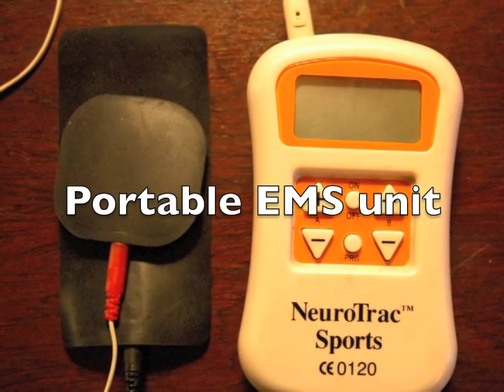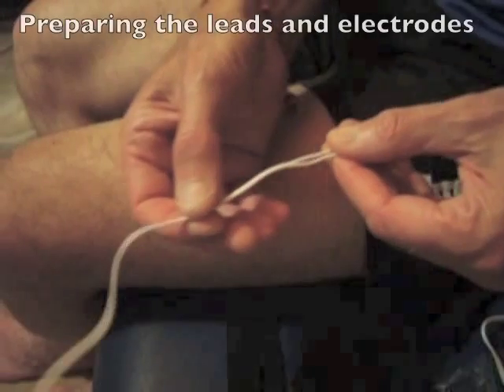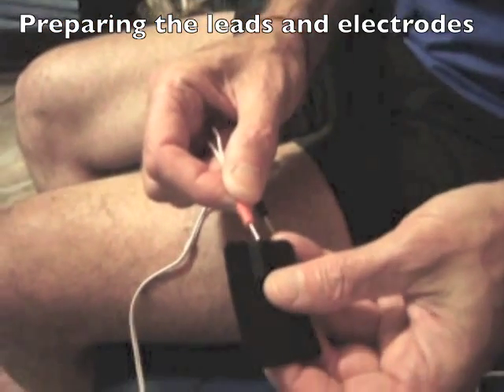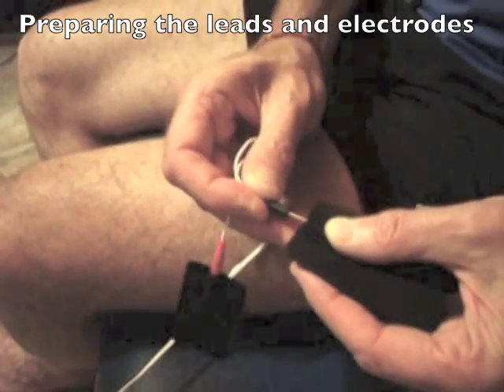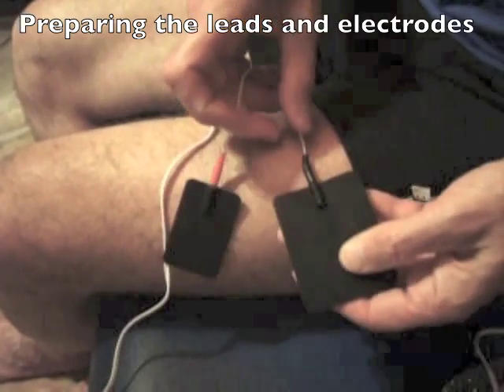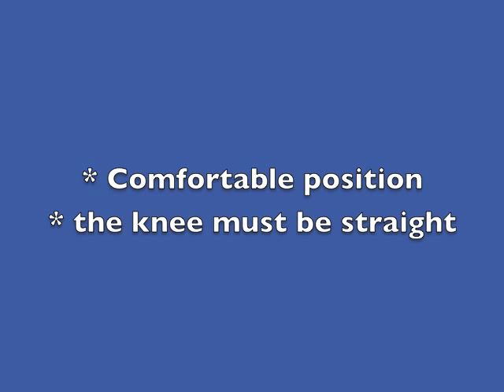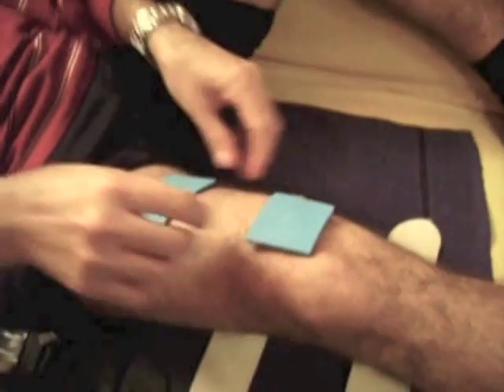For VMO muscle stimulation, it's best to have one bigger and one smaller electrode. The muscle stimulator should stay switched off as you set it up for use. You may need to prepare the lead by separating the wires a little bit, then insert one wire into each of the electrodes. It doesn't matter which wire goes into which electrode as it's an alternating current. Then place the other end of the wire into the contact point on the machine. If you are using rubber electrodes, you need to wet the sponges which go underneath them and leave them fairly wet so that they do not dry out during the treatment session.